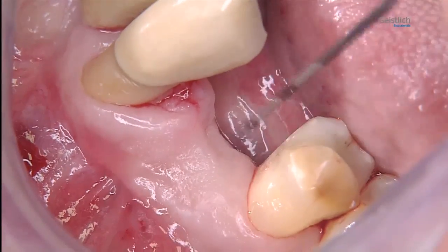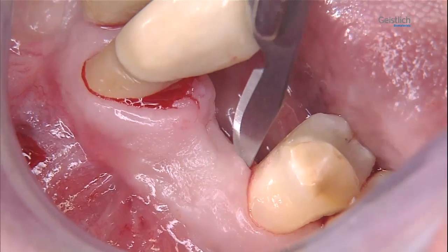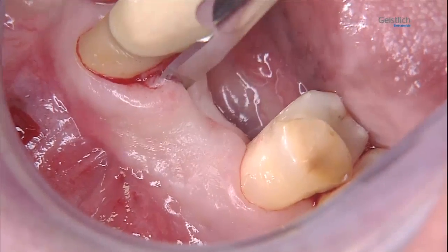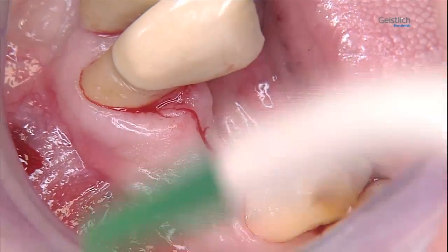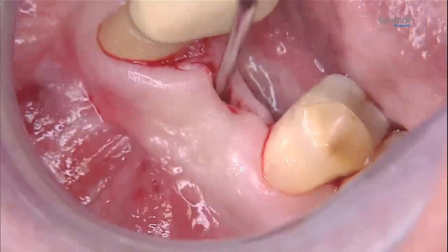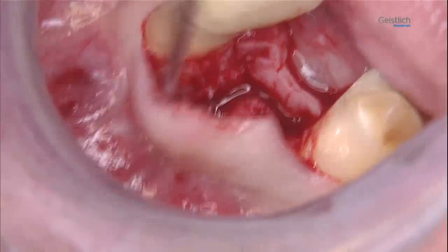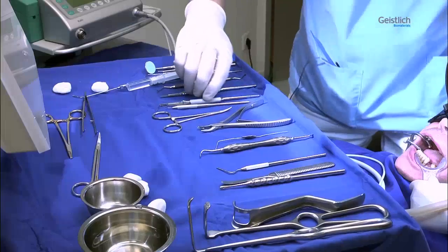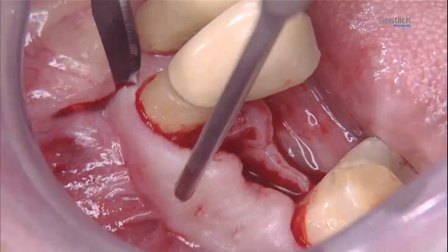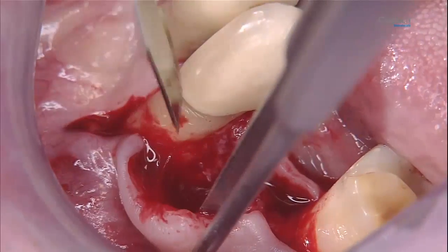First, we explore the depth of attachment of the adjacent teeth with a periodontal probe. The surgical procedure starts with a ridge cut from mesially of 2-3-5 to distally of 2-3-3. This is followed by an initial mobilization of a flap, more cautiously in the lingual direction and more determinedly in the buccal direction. A relief incision vestibularly of 2-3-3, slightly offset toward the mesial surface of the root, allows further elevation of a mucoperiosteal flap.